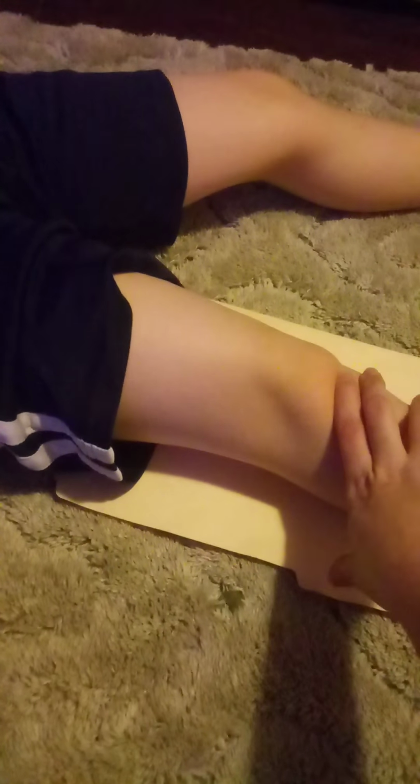For the lateral knee, Caden, turn on your side, baby. Other side. Bend your knee. Not quite so much. There you go.